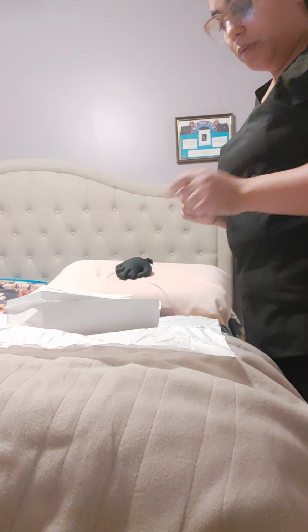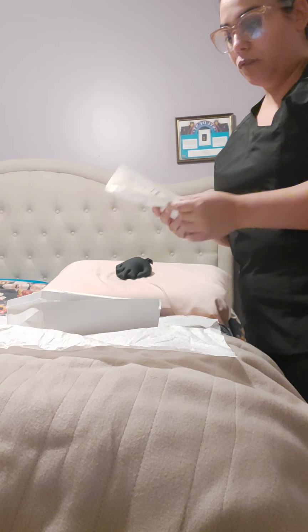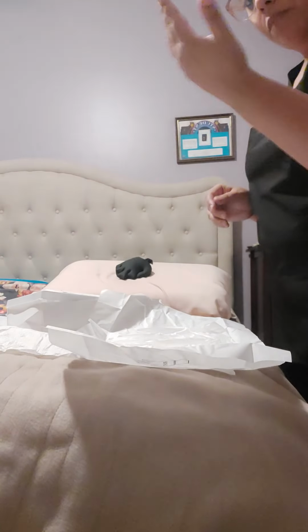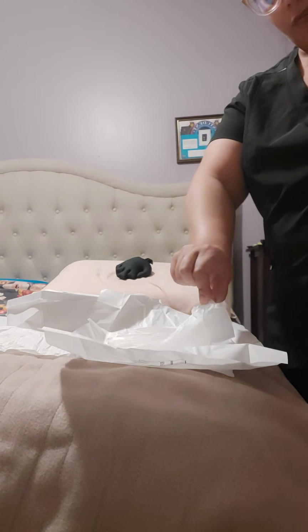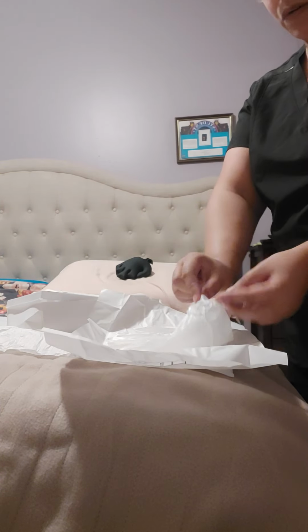Then I would continue by putting my gloves on, and everything within the kit is sterile. And then I would start by putting on my gloves with my dominant hand first. So you can grab the glove from the cuff because the inside is bended up and the inside is not sterile.